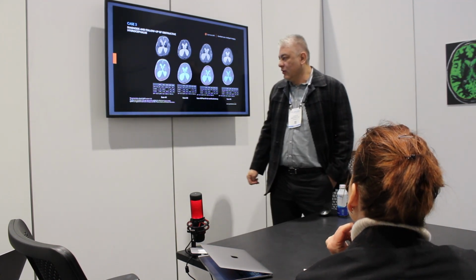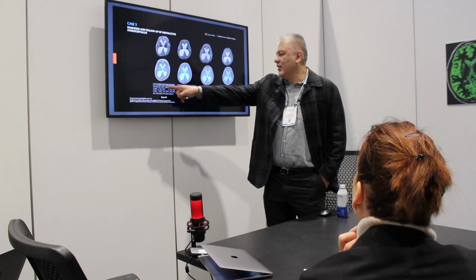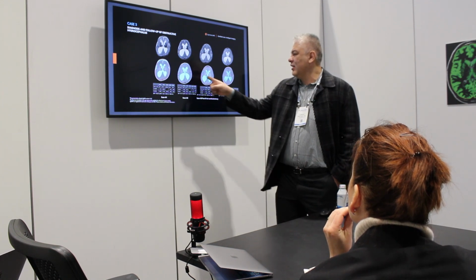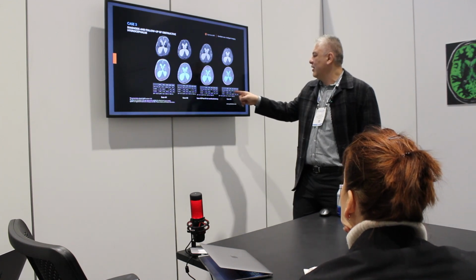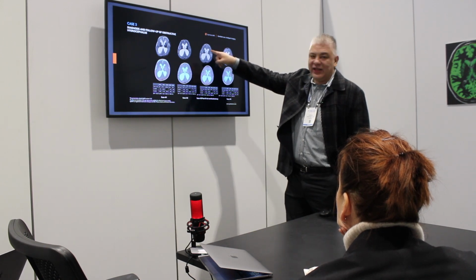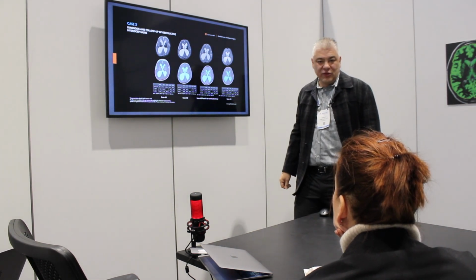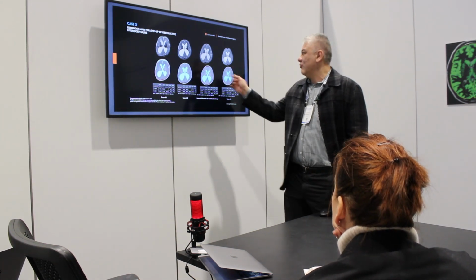We can just follow it up with the volumes themselves, which is a lot more objective and a lot more standardized. So you see, for example, in the first scan, the CSF volume is 238. In the second scan, looks bigger. Now it's 413. And the same on the next one, like this one and this one, now it's 443. And now from here, this is 340. So it got shunted here. You can see how it got shunted. Like there is a little air here. So between this one and this one, there was this shunt placement, and you can see how much it changed after shunting. So you can objectively see by volume how it changed, rather than just trying to be measuring it.